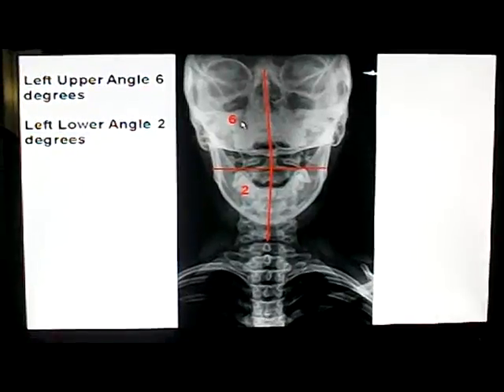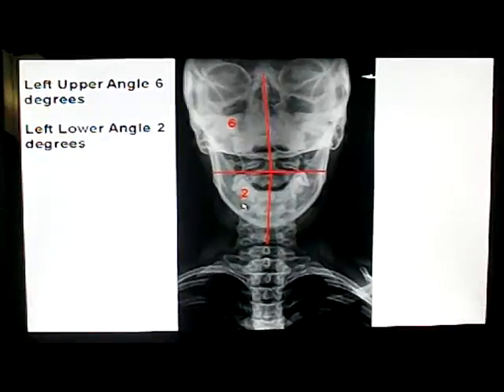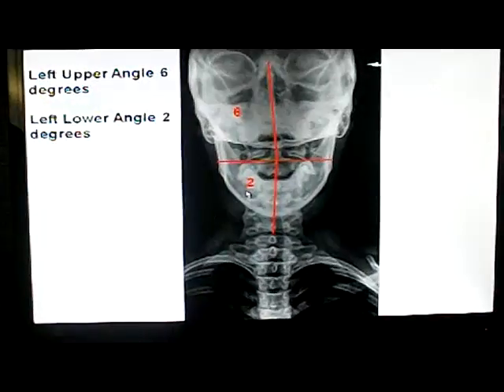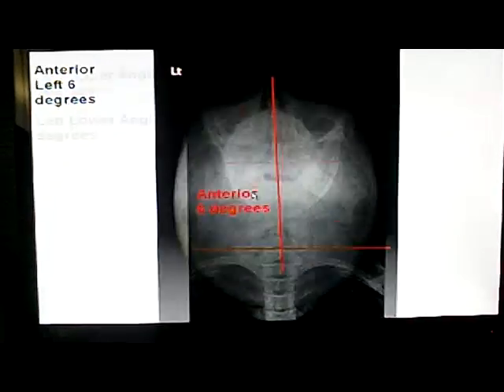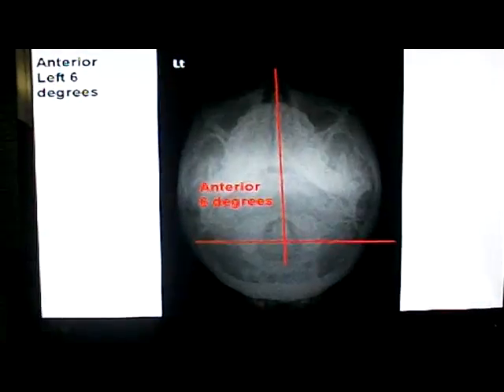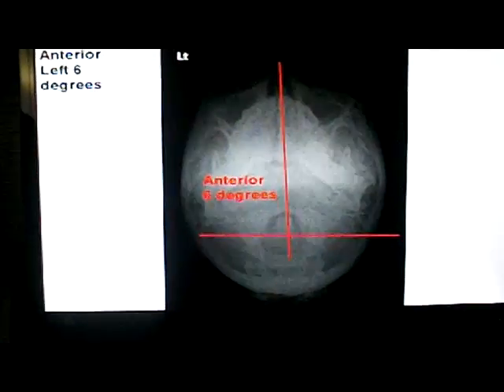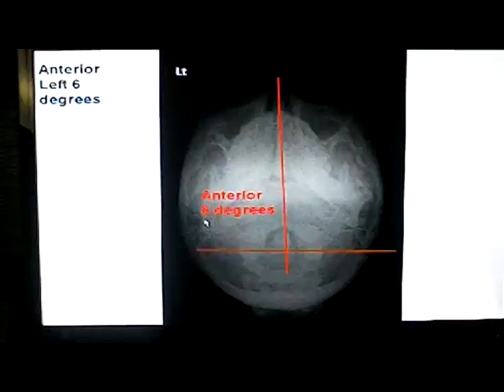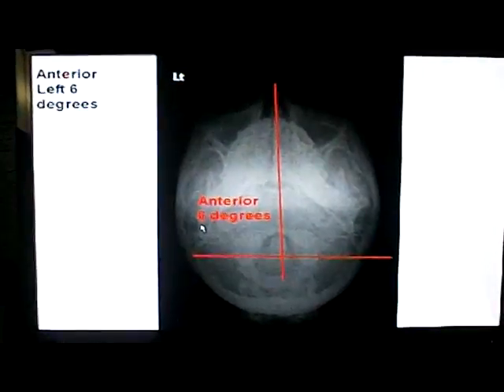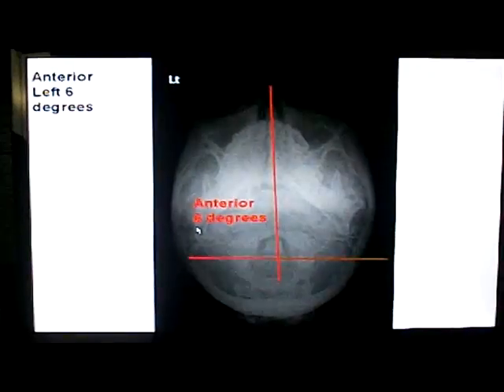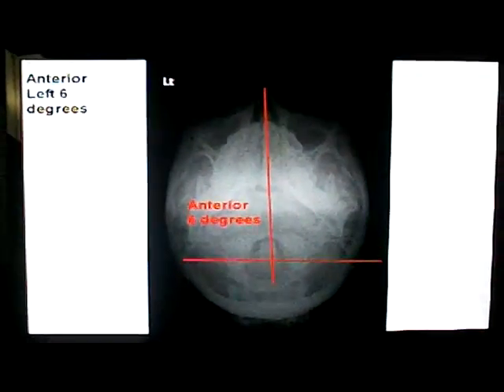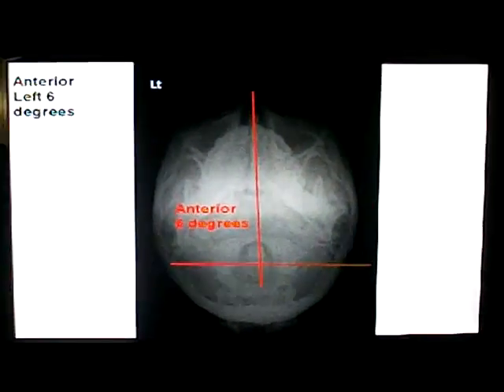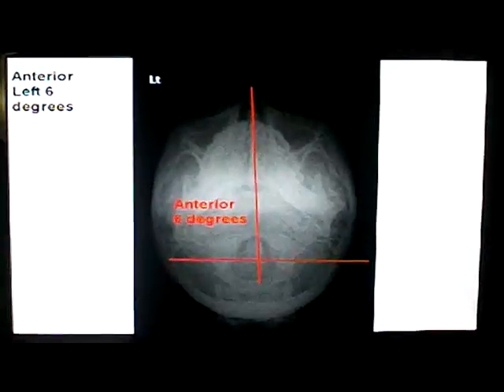So we see there's a left upper angle of 2 degrees, left lower angle — or left upper angle 6 degrees, left lower angle 2 degrees. Most commonly, we also measure the rotation. Here we've got anti-rotational of 6 degrees. This gives us a pretty good idea of the radiographic manifestation of the vertebral subluxation complex.